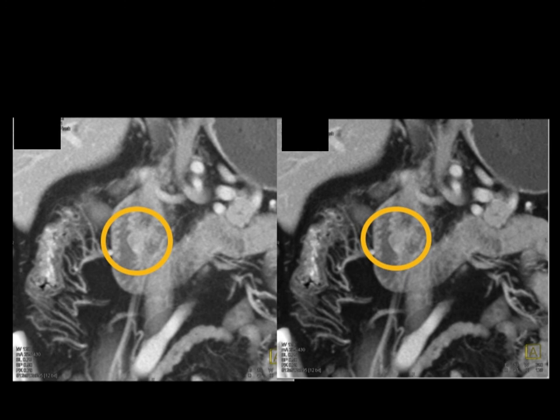You know, things you would think about: distal common bile duct lesion, ampullary lesion as possibilities. And you can see it very nicely. And the lesion has some enhancement, but it's not really anything that I would call hypervascular.